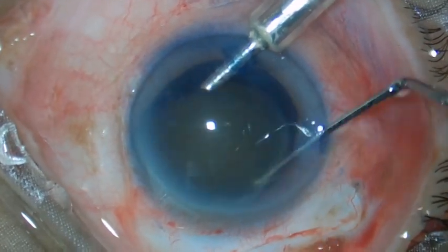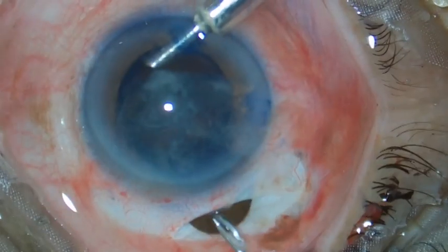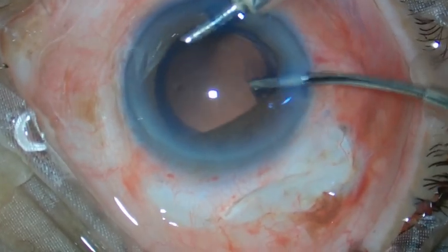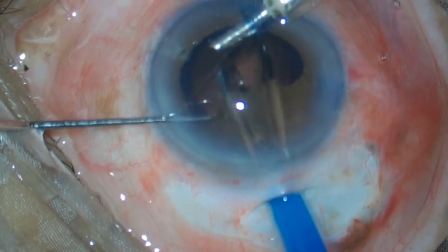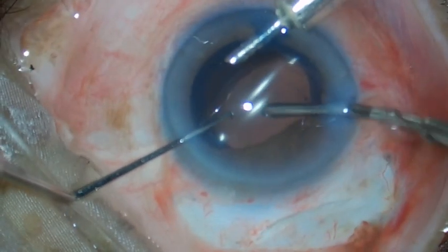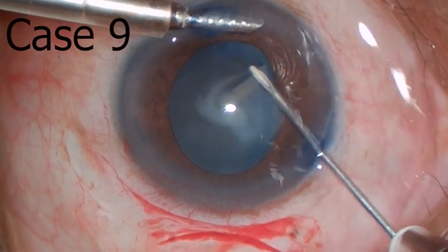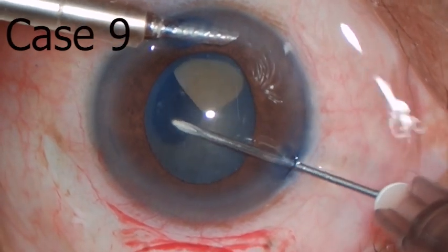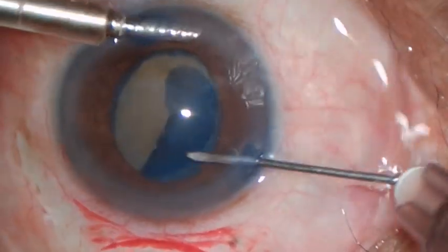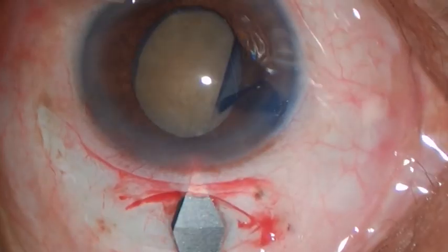In small incision cataract surgeries, we used an AC maintainer in the first two cases, which was popularized by Blumenthal long ago. As in phaco, CCC and IOL implantation were equally safe and easy in small incision cataract surgery. Nucleus delivery is also safe, except that in a few cases we may encounter iris prolapse through the main wound, which can be managed by reducing bottle height. Visco-free surgery needs to be practiced, and only then can a surgeon understand its advantages.